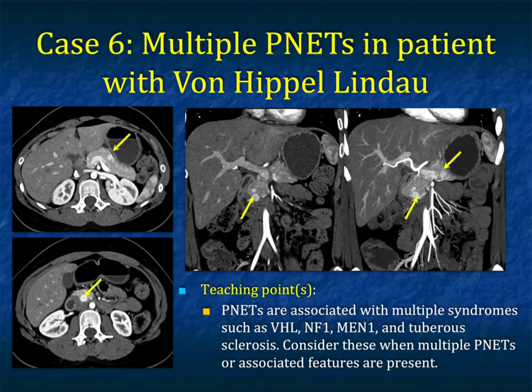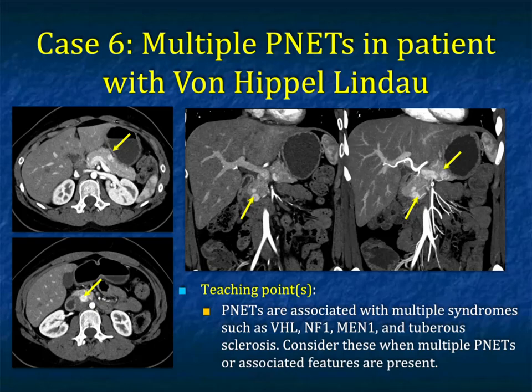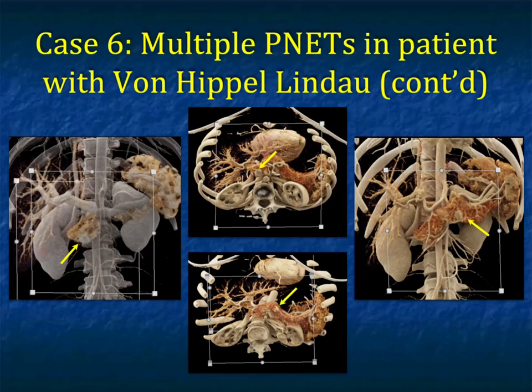Another case: this patient had Von Hippel-Lindau. As mentioned, patients with syndromes can have small but multiple lesions. There's great satisfaction in picking up a lesion, but often when you find one, people miss the second, third, or fourth. Here you can see two lesions in the head and one in the body. Neuroendocrine tumors are associated with Von Hippel-Lindau, neurofibromatosis type 1, MEN type 1, and tuberous sclerosis. You should consider these possibilities when you pick up multiple neuroendocrine tumors — sometimes the patient is not known to have one of these syndromes. Cinematic rendering very nicely shows many of the lesions across a spectrum of images.